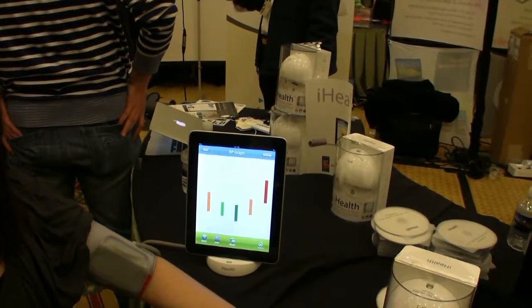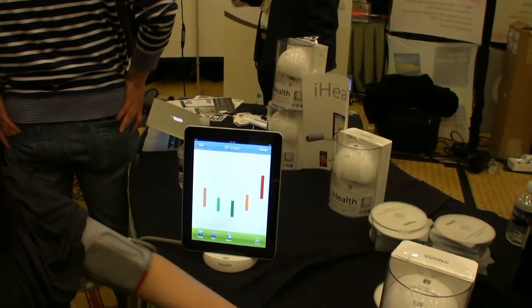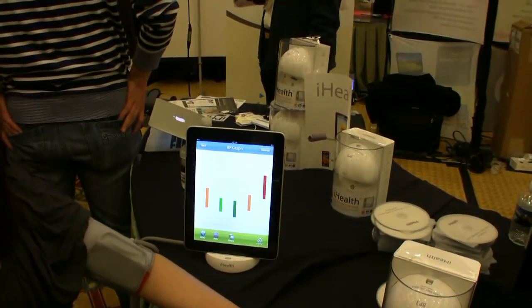The iHealth is $99 and it's available on the iHealth website, iHealth99.com. Looks like a great product, and again this is Kelly from LockerGnome.com.